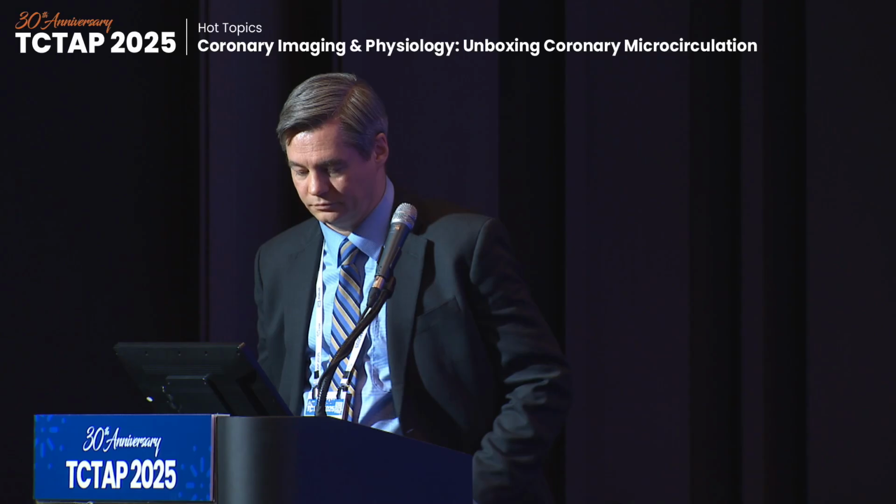I have to say that when you think about which test is most important in these patients, in our practice, spasm testing is one of the most important because, one, you have an action linked to that, a medication that makes the patient feel better after the procedure, and the prevalence is not small. The Japanese data, the Dutch data, the Belgian data all point to a prevalence of about 40 to 60% spasm, so that's a lot. And those patients feel better after you give the correct therapy. So I think this should be encouraged, especially in patients with ANOCA or MINOCA.